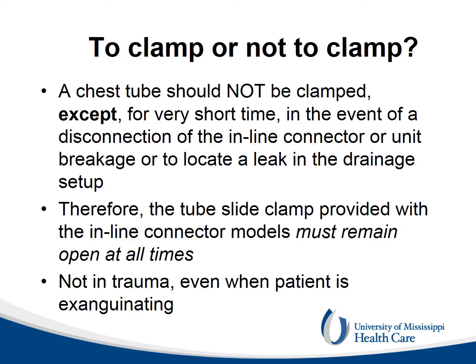This is a source of debate. My opinion is that a chest tube should not be clamped under ordinary circumstances. Some people clamp the chest tube for hours in order to detect very small air leaks. This is not necessary since the falling negative pressure in the collecting chamber on water seal would indicate so.